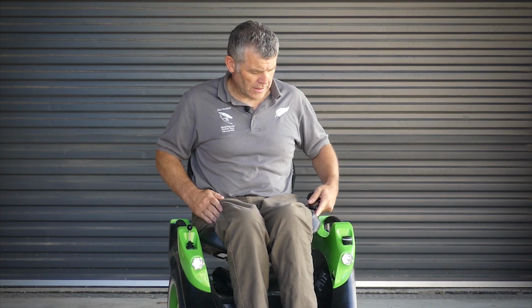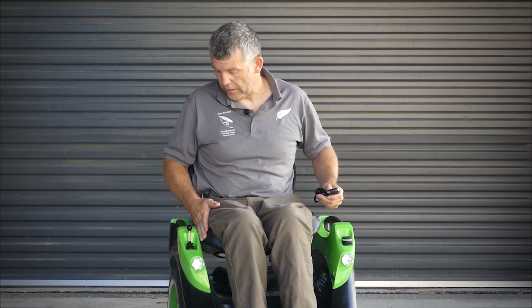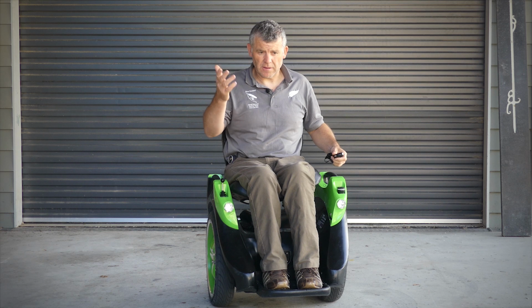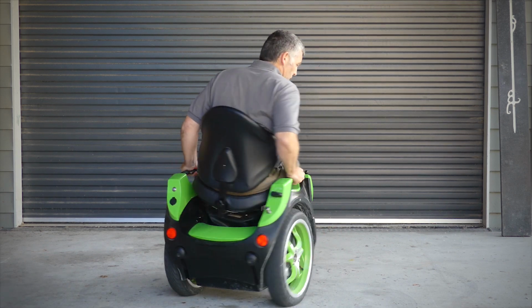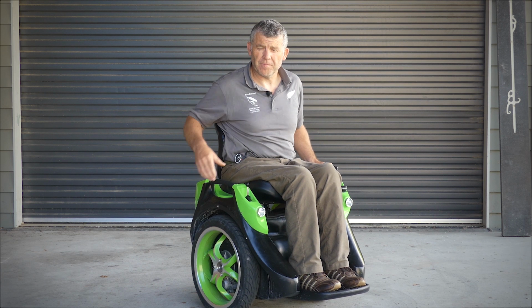Look down if you're unsure, and look at the gap between the side of the seat on one side and the gap on, or the lack of gap on the side of the seat, and that'll tell you if you've got your seat wildly at an angle. If I was to go onto seat steer at this point in time, I would start turning to the side. And it's also gone into shutdown.